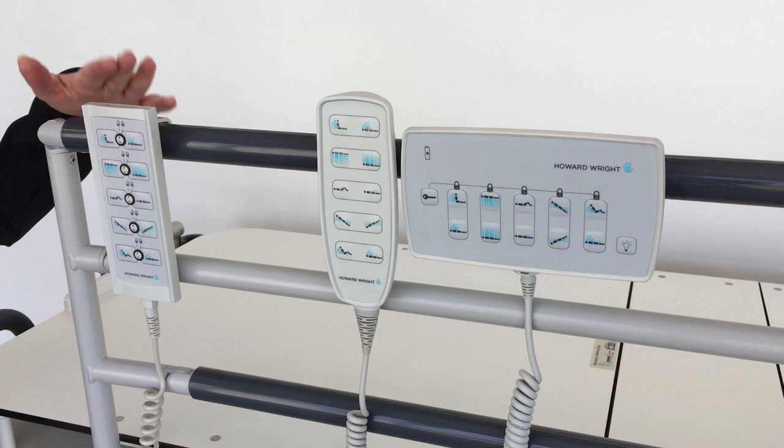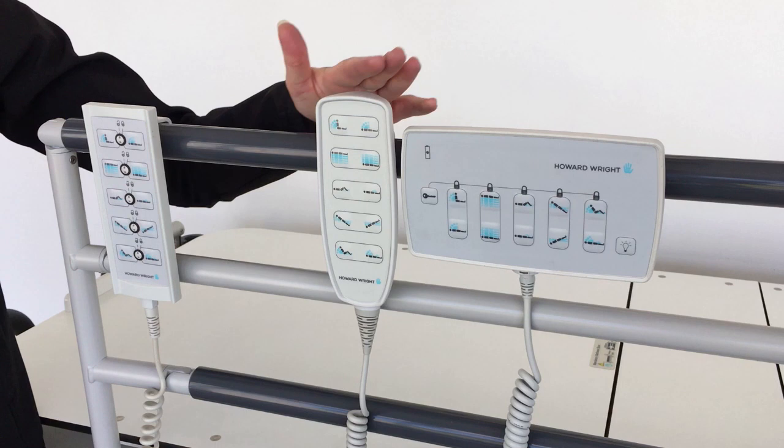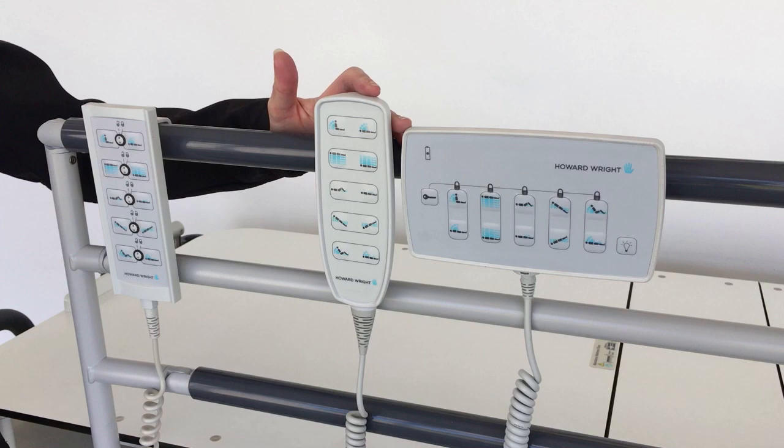Let's start with the two electric control options. The first option has a basic handset at the head end. The second option has a backlit handset at the head end and an attendant control handset at the foot end. An attendant control handset has the same buttons as a backlit handset, but also includes function lockouts, a battery indicator and an underbed light.